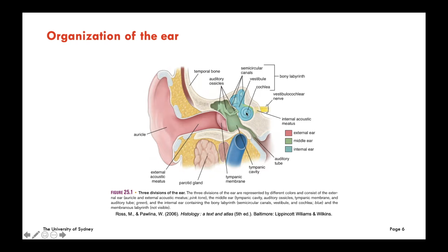So describing the pathology of the ear, essentially, if you have a problem in the external ear or the middle ear, one experiences conductive hearing loss, whereas a problem with the inner ear causes sensorineural hearing loss. In this presentation, you're going to understand how to distinguish these two types of hearing loss using pure tone audiometry.